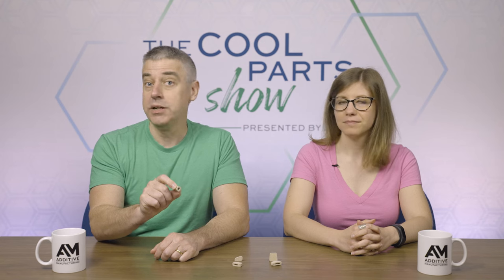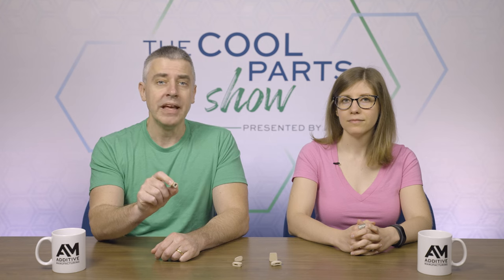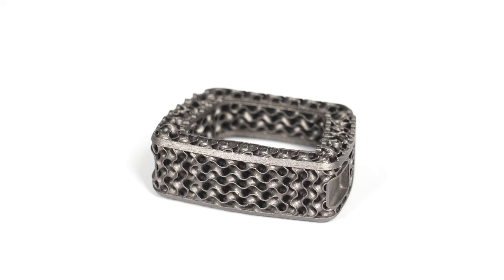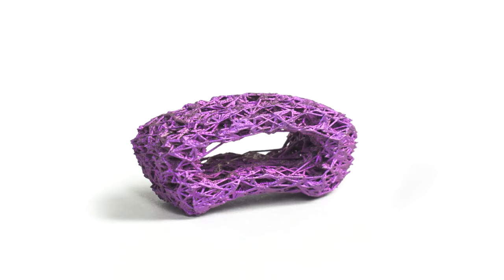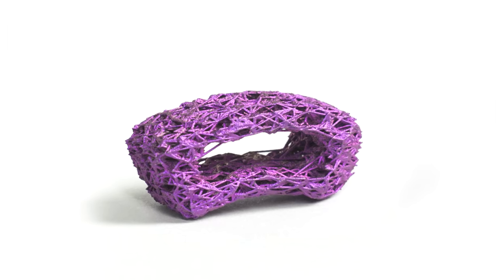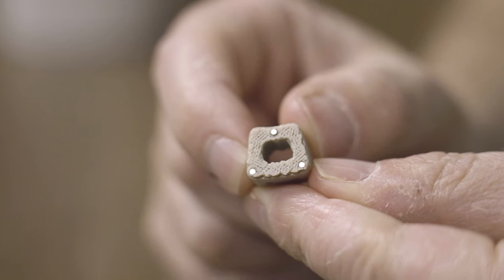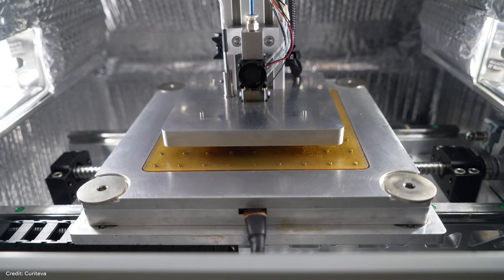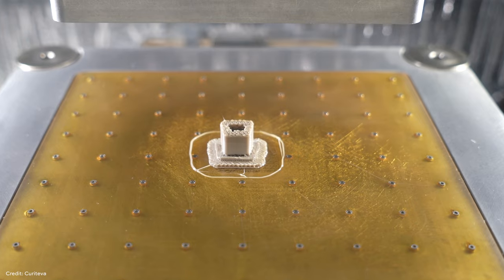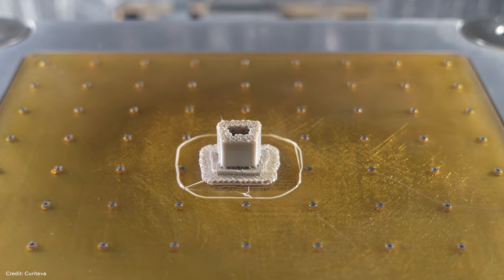We have covered 3D printed spine implants in articles on additivemanufacturing.media, even on The Cool Parts Show. But those 3D printed implants have been made of metal, made of titanium, and produced through powder bed fusion. This spine implant tells a very different story. This is a polymer, and it was made through a different process. It was made through a deposition style 3D printing process, a variation on fused filament fabrication. So different process, different material, and the exact material is important here too.